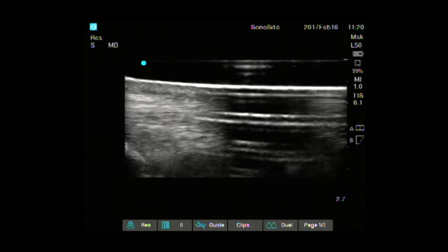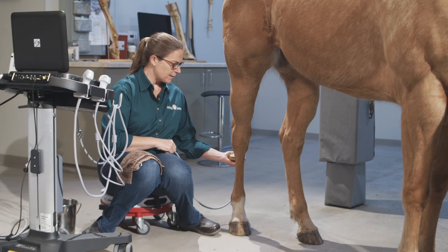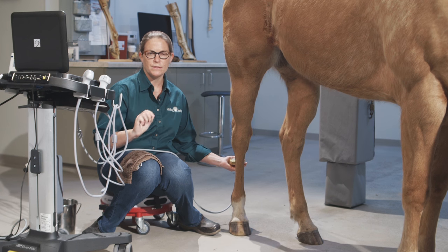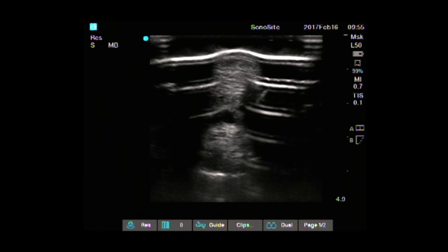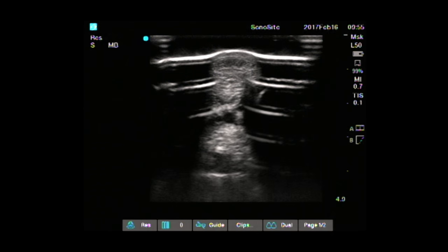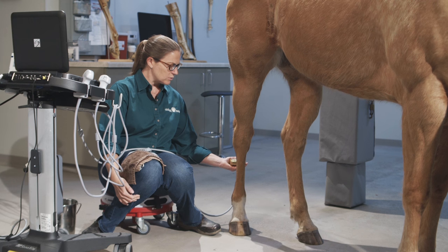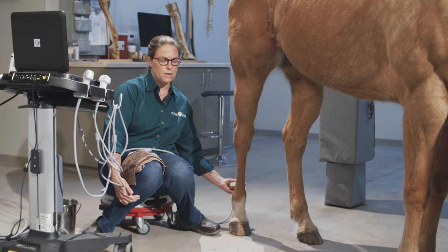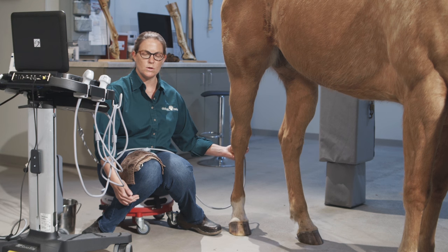When I find a lesion or problem in the suspensory, I go back to that area and take an image one to two centimeters above it where I consider it more normal, then drop down into the worst part of the lesion. At that level, I measure how distal I am from the point of the hock and take a measurement and image. Then I go to the next normal spot in the ligament and take a measurement and image — so I have documented normal, documented abnormal, and documented normal images of the lesion. If there's more than one lesion, I do that for each injury. I also use the clip function to video the entire abnormal section.